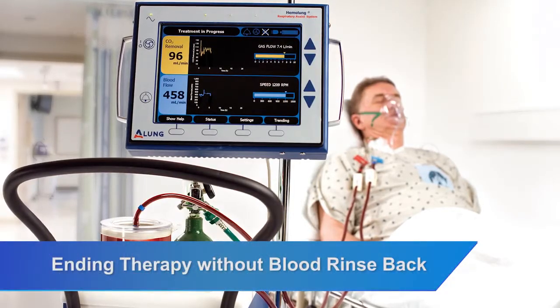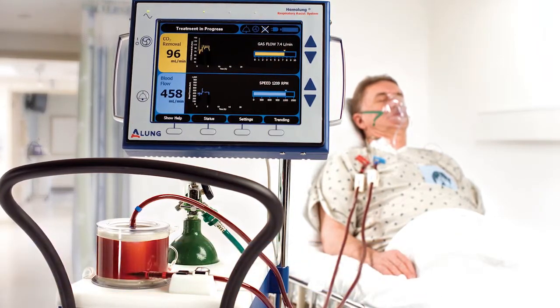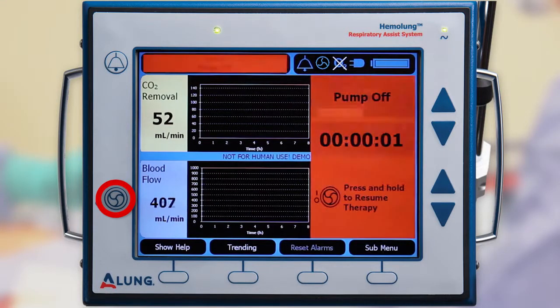Ending therapy without blood rinse back. Following therapy, the physician may decide that returning blood to the patient is not necessary. Press and hold the pump start-stop button to stop the pump.